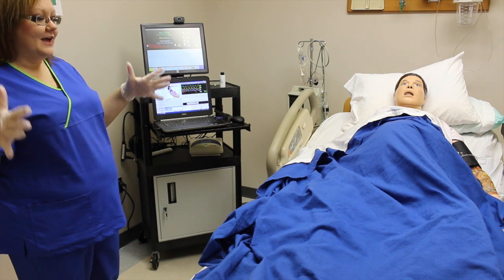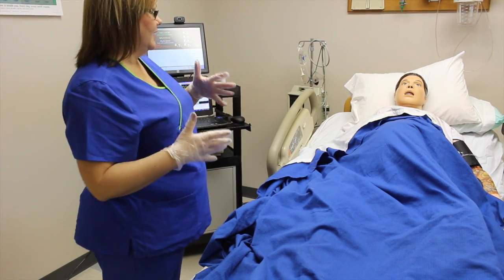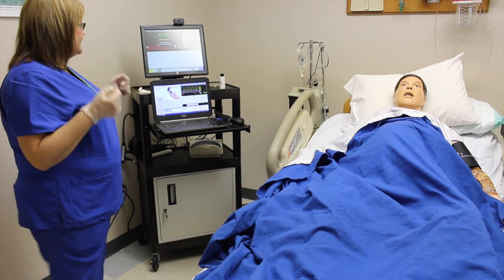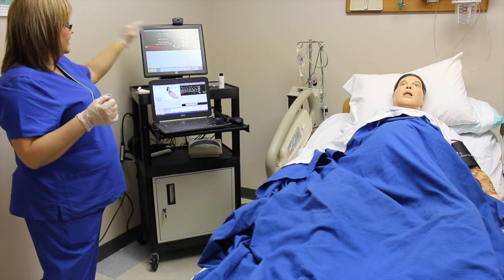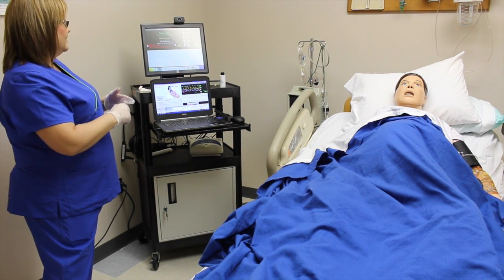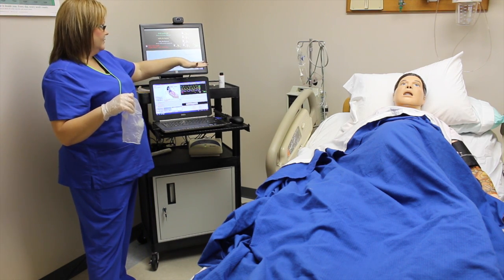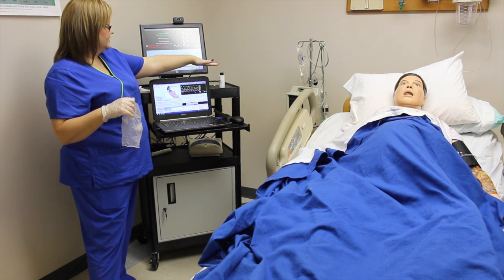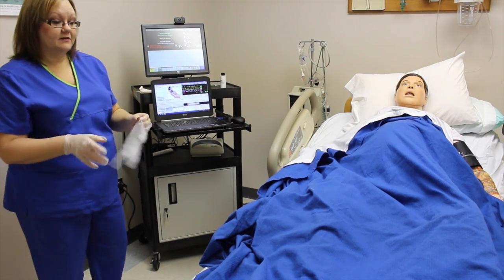Here we're going to look at a normal labor pattern for a patient in the obstetric setting. What we have right here is the fetal monitor, which is already on. There's a contraction showing on the screen with an acceleration in the heart rate. The contractions will be about every 2 minutes, lasting about 60 seconds. There will be occasional accelerations, as you will see.